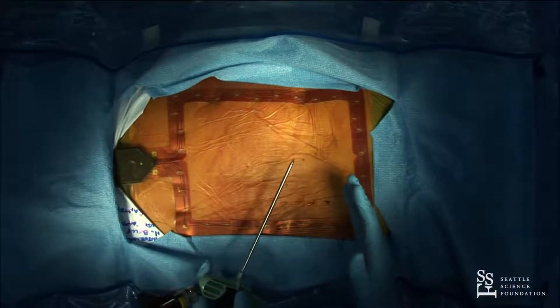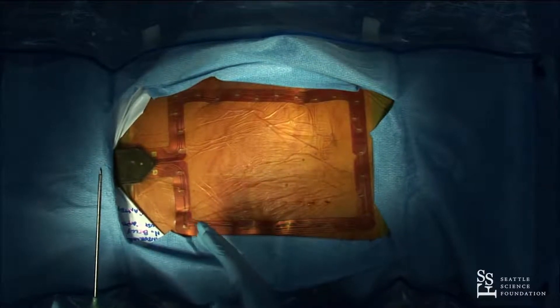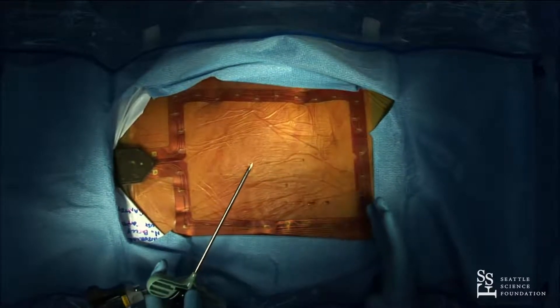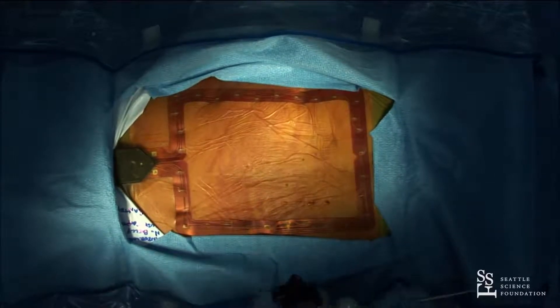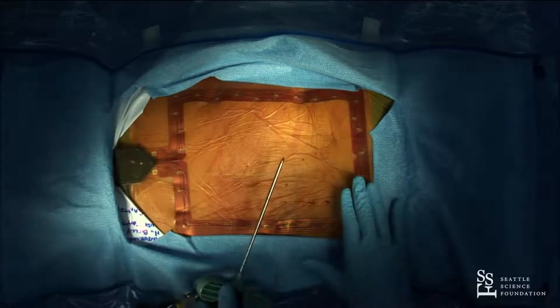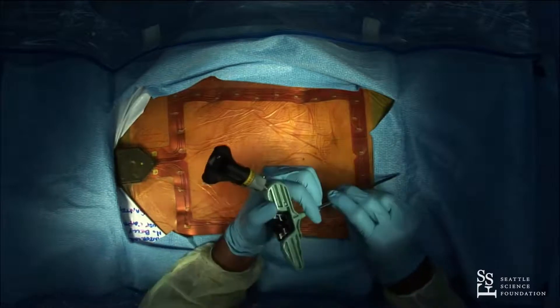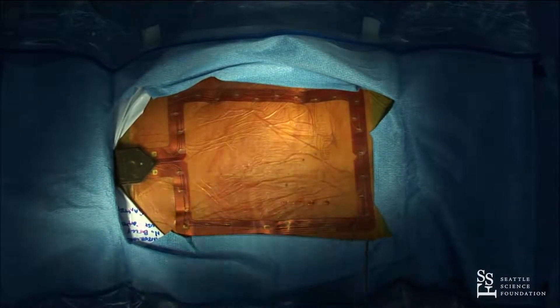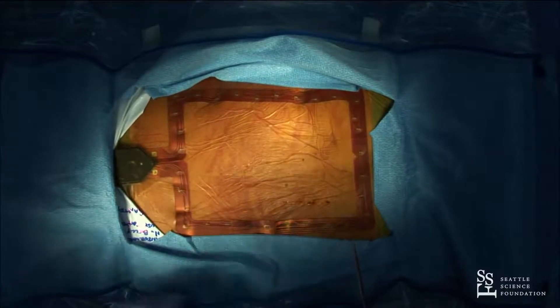If I'm doing a TLIF, especially a multi-level TLIF, I'll actually put the mask up into the thoracic spine and work below the mask. The mask doesn't have to surround the area you're working. By moving it out of the way, I avoid blocking the trackers with my hands and prevent the navigation from losing line of sight.